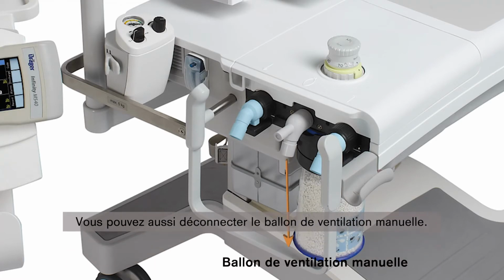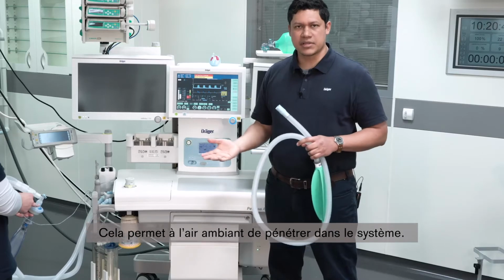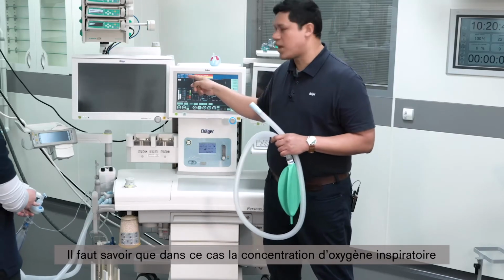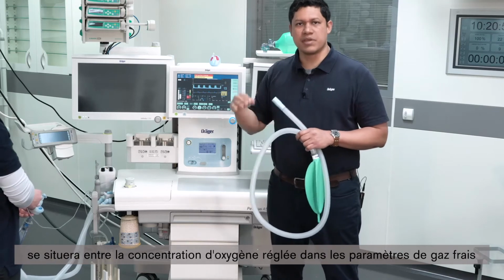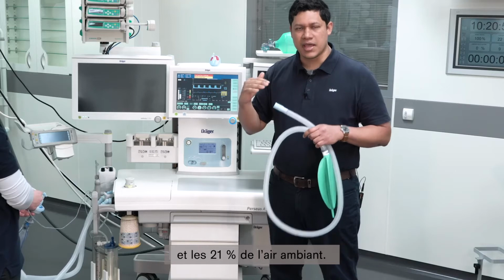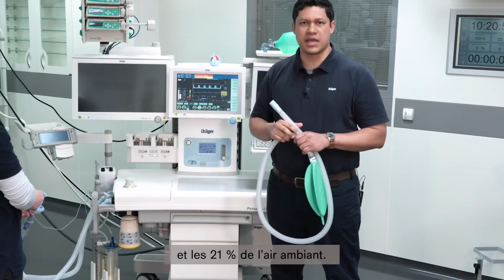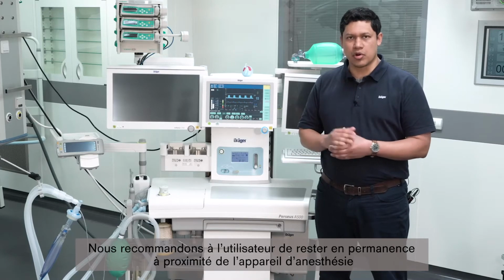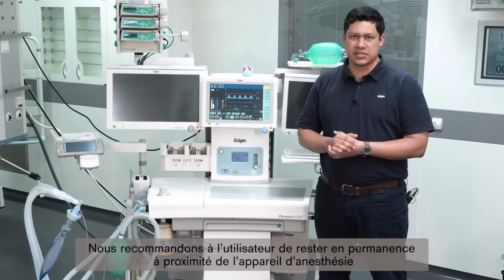Additionally, you can detach the manual breathing bag from the system. This will allow ambient air to enter the system. In this case, be aware that the inspired fraction of oxygen will be between the set percentage of oxygen in the fresh gas flow and 21% oxygen from the ambient air. Our recommendation is that the user should always be in the vicinity of the anesthesia device.